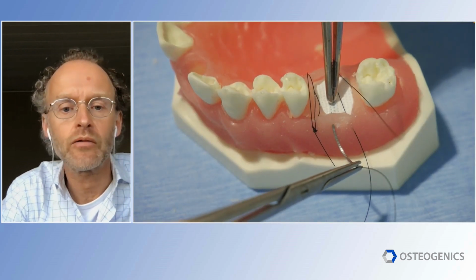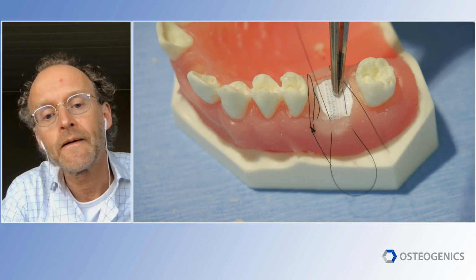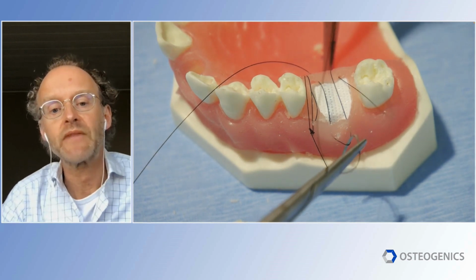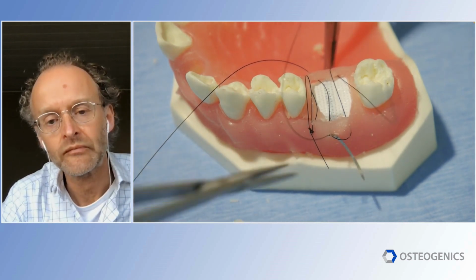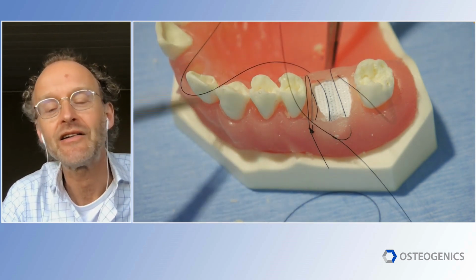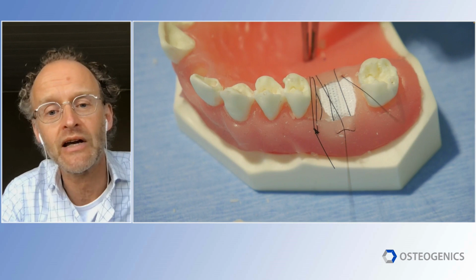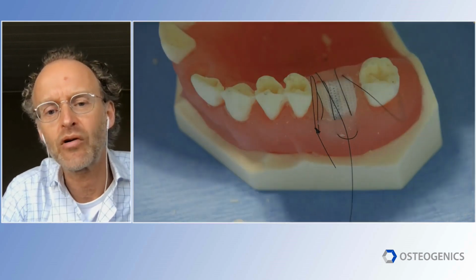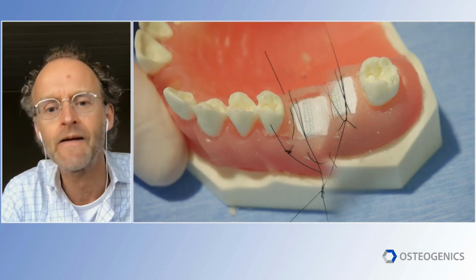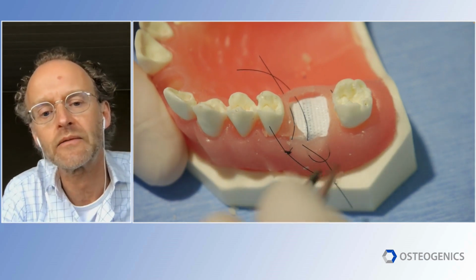What about suturing? Well, we often use a horizontal mattress suture, as you've seen here, to cover the membrane and to keep it also in place. And we use it with a sling, as you can see here. And now the difficult part becomes when you start using this technique. Do not, I repeat, do not close the tissues. And that's hard because we're all trained to start pulling and getting more closed. And in the beginning, it's a little bit scary. Can I leave the membrane open? Yes, you can. Just very little tension, because else you move up the mucogingival line.